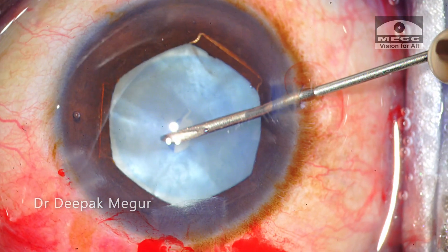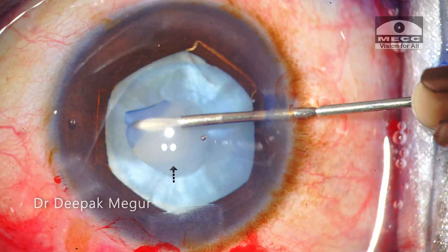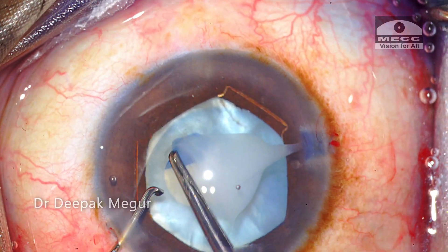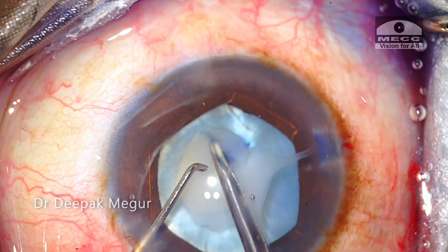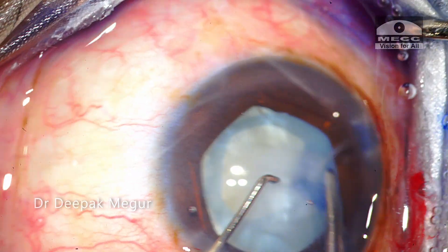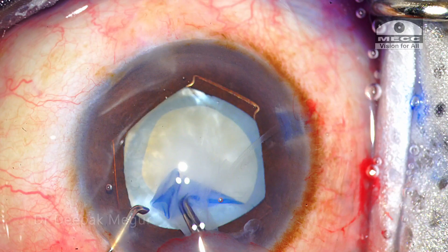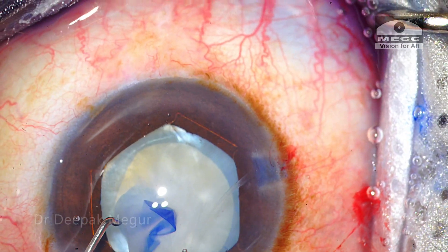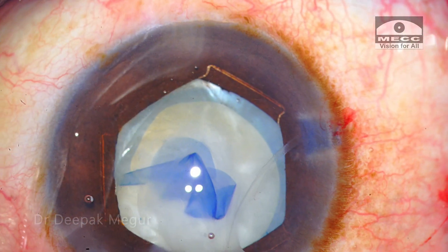There is aggressive fluid cortex out of the bag as soon as the anterior capsule is punctured. Instead of my usual technique of performing the two-stage rhexis, I'm performing the rhexis in a single shot because I believed that at this point the intracapsular pressure is not very high and I could get away by doing the CCC at one go. But overconfidence is not a good thing, as I realized immediately — the rhexis tear has extended to the equator and I could not retrieve it.